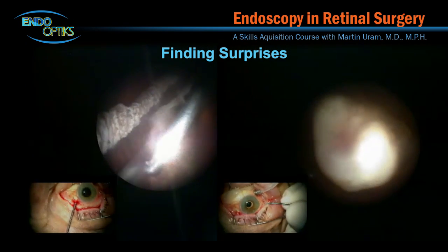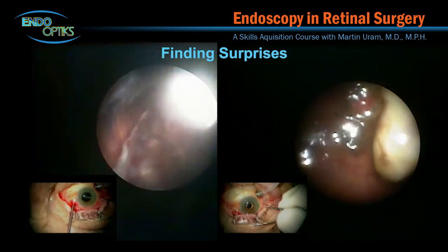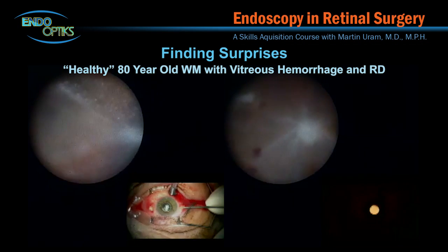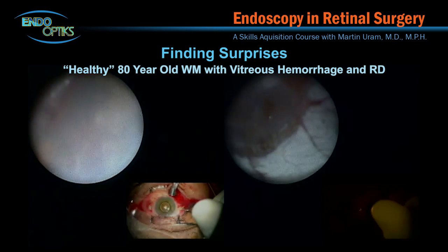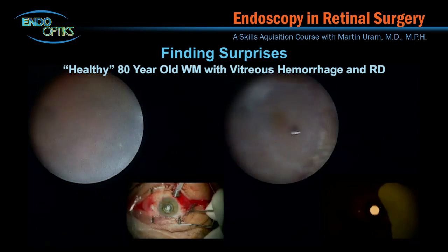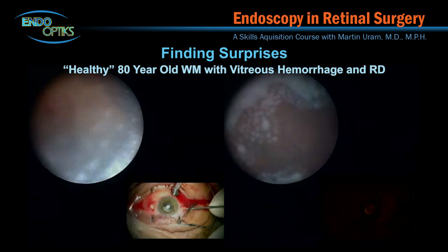In this example, a vitrectomy for vitreous hemorrhage and retinal detachment was planned, but once the blood was cleared and the retina reattached, the tumor was observed. In this situation, an otherwise healthy 80-year-old man presented with vitreous hemorrhage and retinal detachment. But once the view was cleared, acute retinal necrosis syndrome was observed. The video on the right shows the reattached retina with laser applications and silicone oil fill, along with extensive peripheral retinal necrosis, optic atrophy, and attenuation of the retinal vasculature.